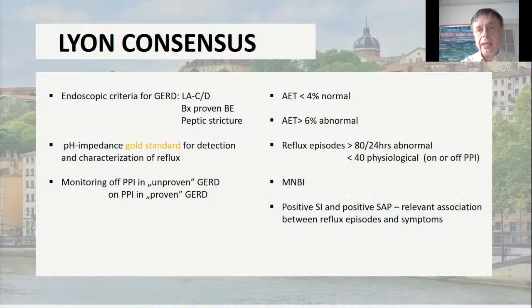Problem je u cijeni. To je svima, i vama i nama. Moramo biti prilično racionalni s korištenjem impedanca katetera. Gdje god možemo upotrijebiti klasični pH-metrijski kateter, upotrijebiti ga, jer je ogromna razlika u cijeni. Ali gdje postoji razlika, tu moramo svaki za sebe razmisliti i odlučiti: idemo na impedancu. Nekada od prvog akta, jer uvijek klasičnu manometriju napravite prije toga. Ako vidite da postoji nespecifični motorički poremećaj, onda svakako impedanca kateter.